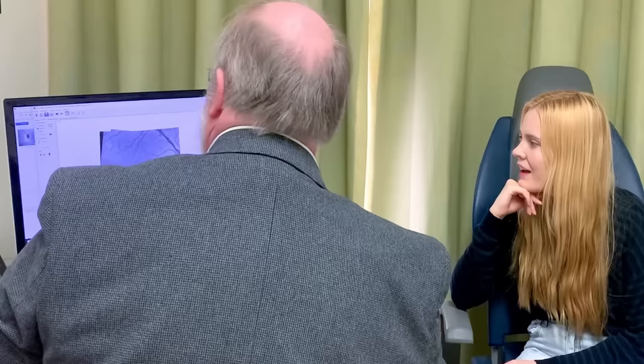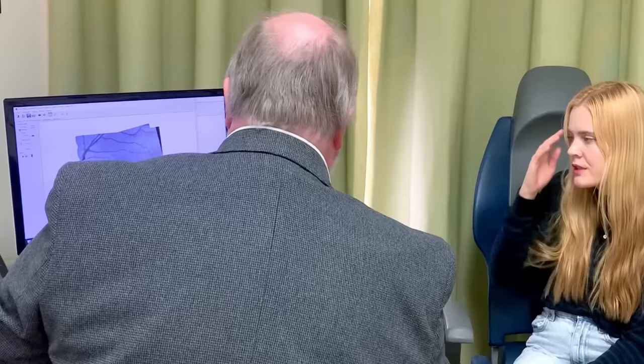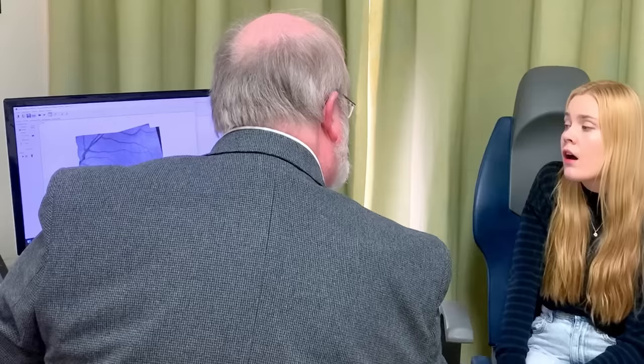Good. So again, we can see other changes, for instance, if you had diabetes, things like that, you can see it quite avidly in these images. It's amazing that the eyes show the health of the body. They show a lot of different problems, a lot of neurological problems, things like this as well. So I'll show you our field test plot in a moment.